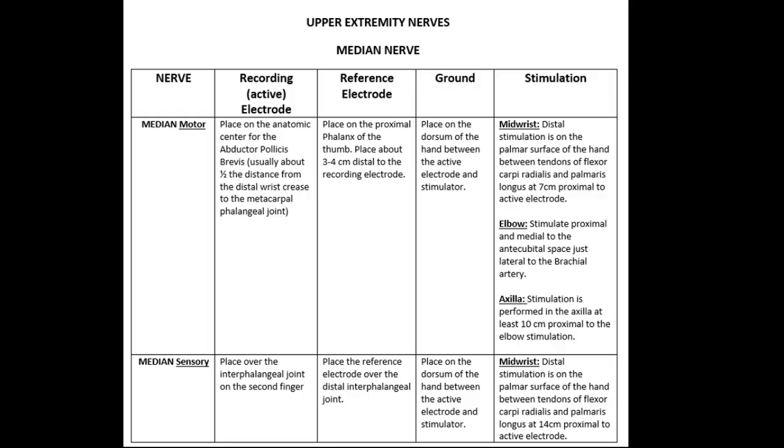Now, as we do the study, I tend to do the sensory study first before the motor study. The reason is that when you do the sensory study, you need a very small electrical current. It's like 3 to 5 milliamperes. Every time you shock, you go up by 3 to 5. But max by 30, you should get your max response for sensory. But for motor, because it goes higher, it's naturally more annoying and makes the patient more uncomfortable. So the sensory study is more to get them acclimatized to what you are trying to do with them.